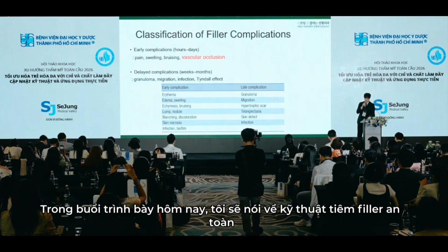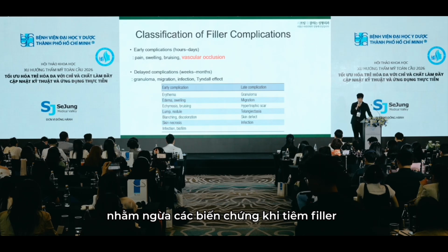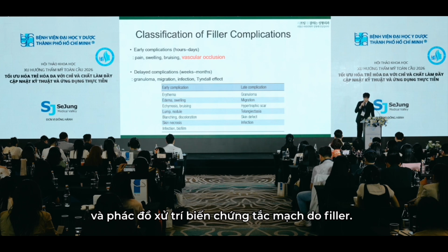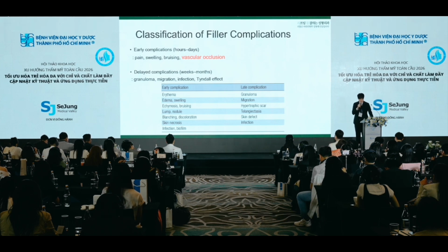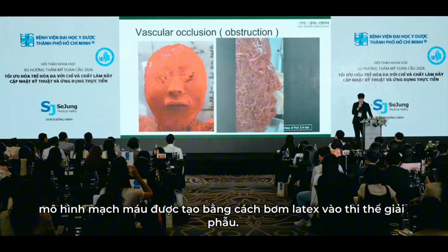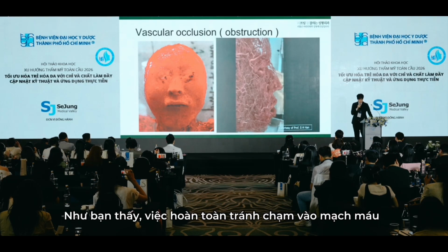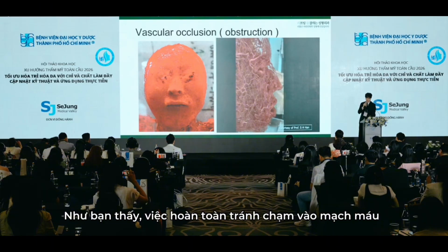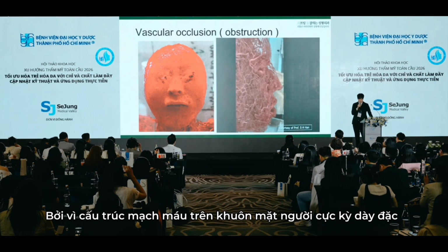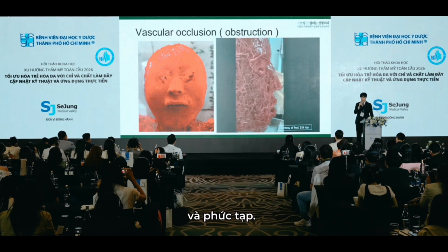In today's presentation, I will discuss safe filler injection technique to prevent filler complication and the protocol for managing filler-related vascular adverse event. Here you can see a facial vascular model created by injecting latex into a cadaver. As you can tell, it's extremely difficult to completely avoid vessels during filler injection because the human face contains an incredibly rich and complex vascular network.